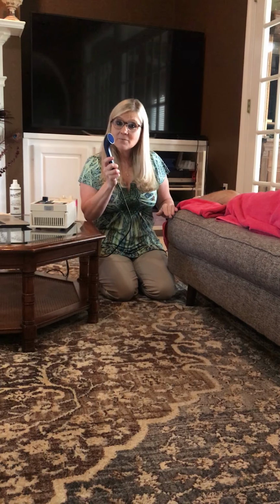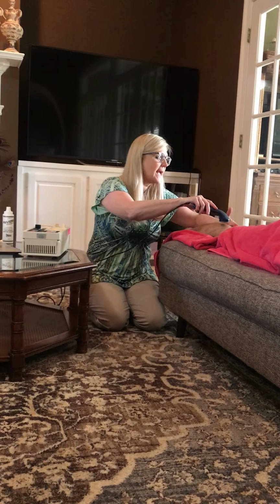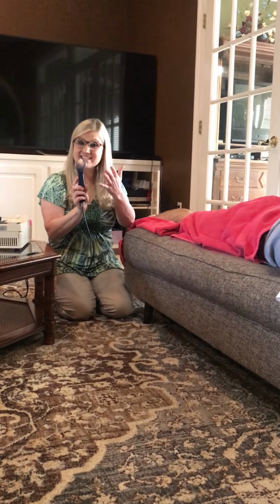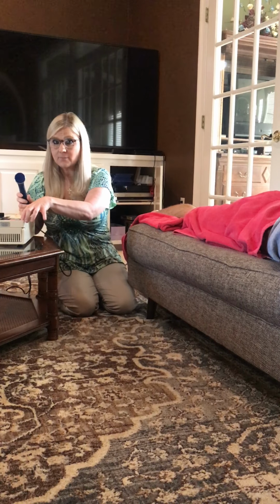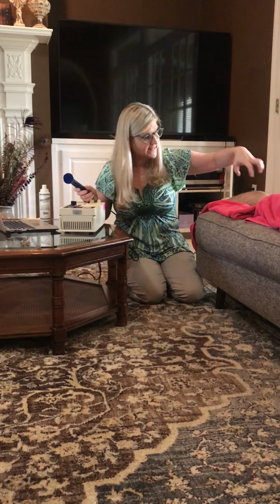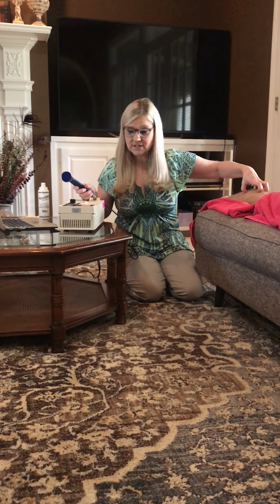You're going to look at time component. So 2 sound heads equals about 5 minutes. And we're going to be doing an area on him of 3 sound heads, so that's 7.5 minutes that we're going to set up on our machine. We have our machine frequency set up for 1 to go into that deeper penetration of the muscle tissue.